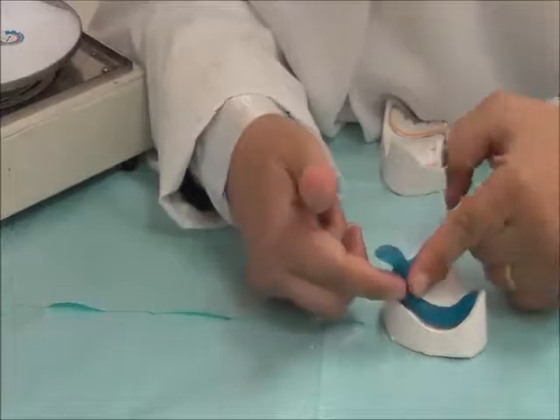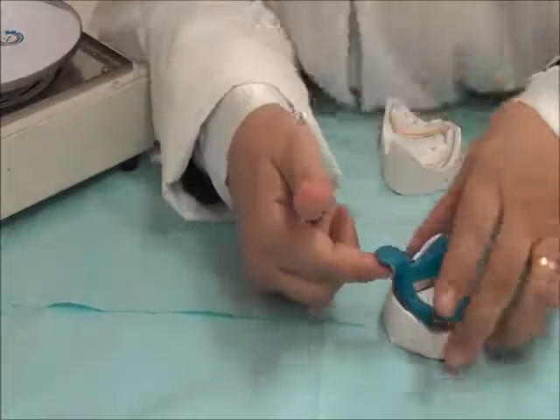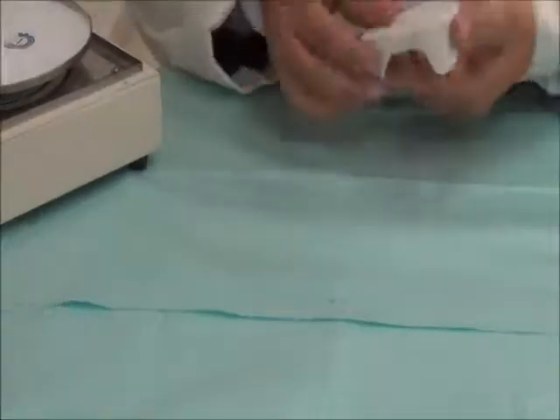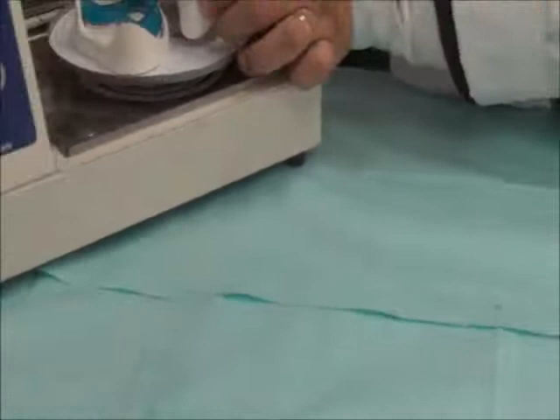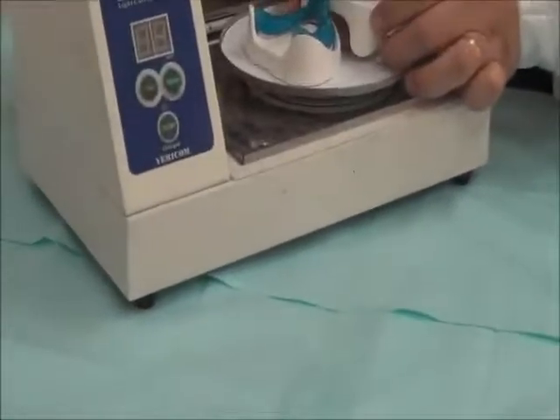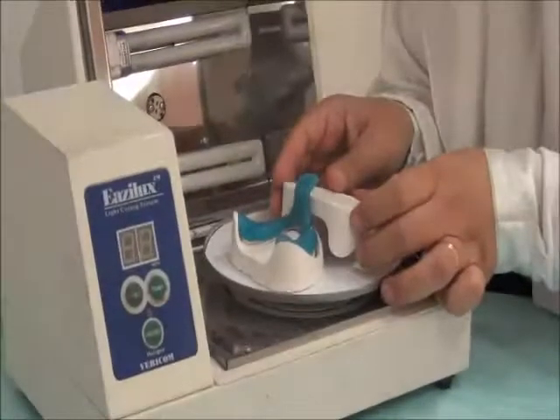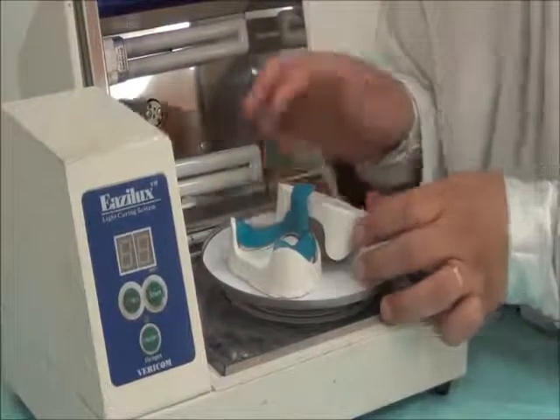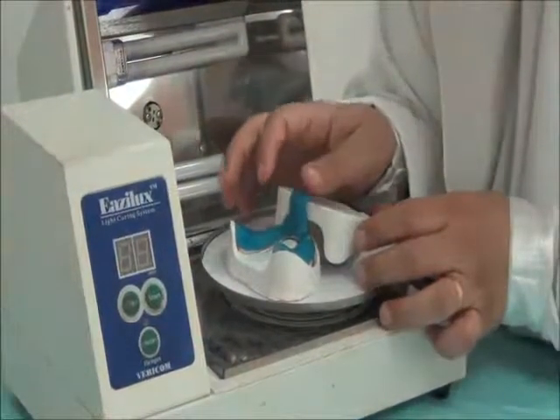So once more, I begin my curing with a material with support. I could place an old cast to do this purpose. I support my material so it doesn't slump in a manner that we don't want.